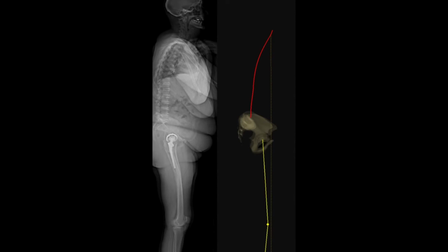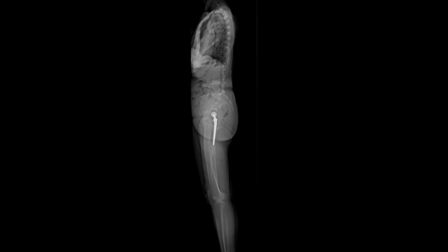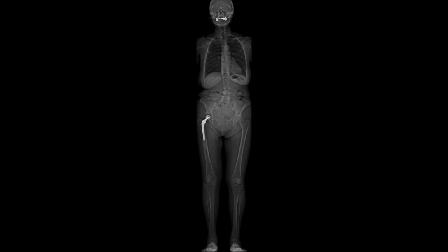For spine surgery, the analysis of the sagittal and frontal balance is a key point for scoliosis, for osteotomies in the cases of correction of imbalance. In degenerative pathologies of hip and knee, it is also very important to have the full image of the patient for the planning of and the adjustment of the prosthesis.